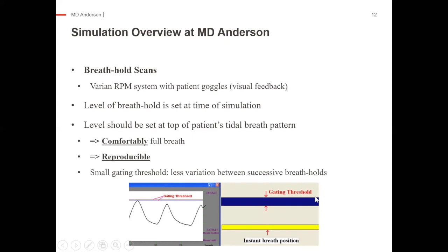And we want this threshold to be not that large. And this is to prevent a lot of variation between successive breath holds.